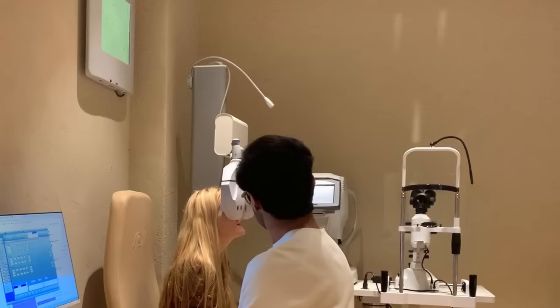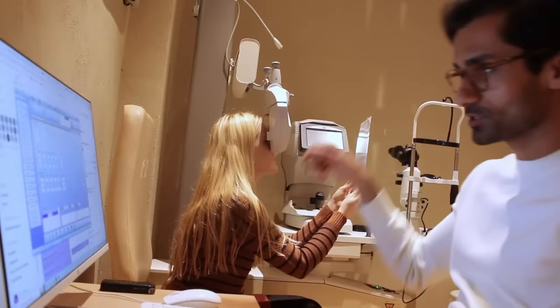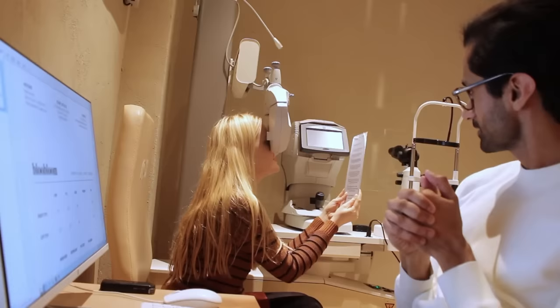And then that's with the prescription. Yeah, that's so much better. One last thing. Can you hold that for me? What's the smallest line you can read on that chart? If I put it quite close, I can probably read N4, the smallest one. The top line? Yeah, if it's like here. What about if it was... If it's here, then I'd go for N5. Okay. I think N4's a bit of a stretch.